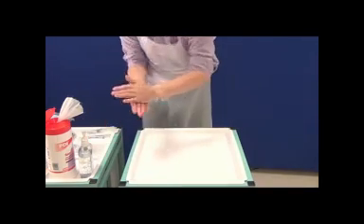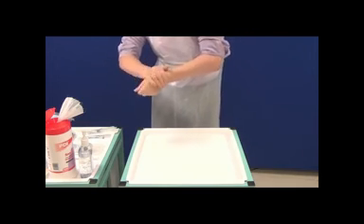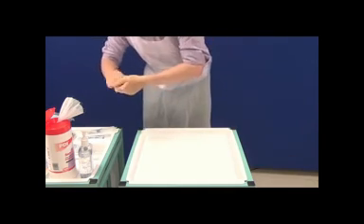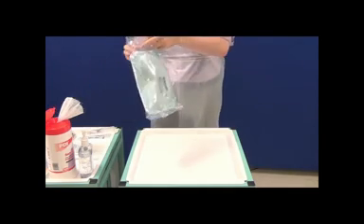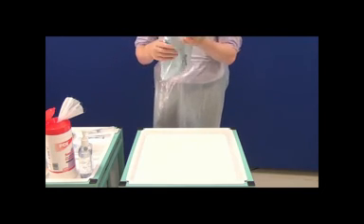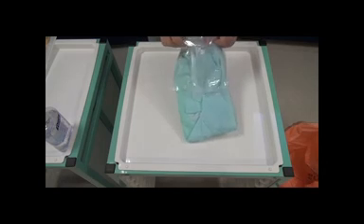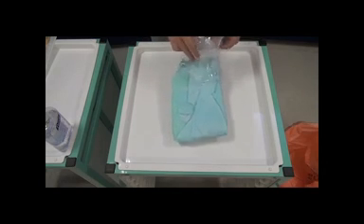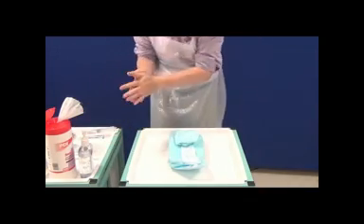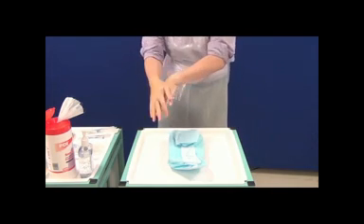Wash your hands again since you've been cleaning. And then, having checked the expiry date on the catheter pack, open it and place the inner packet on the newly cleaned area. Since you've been touching outer packaging, wash your hands thoroughly again because you're about to touch what is to become the sterile field.